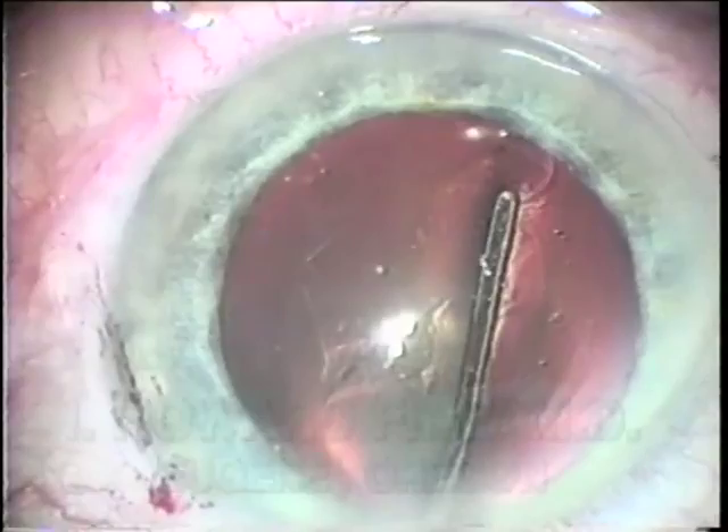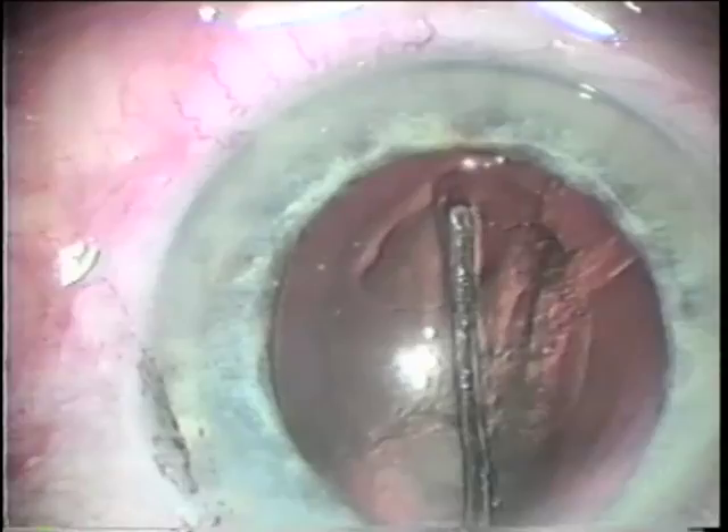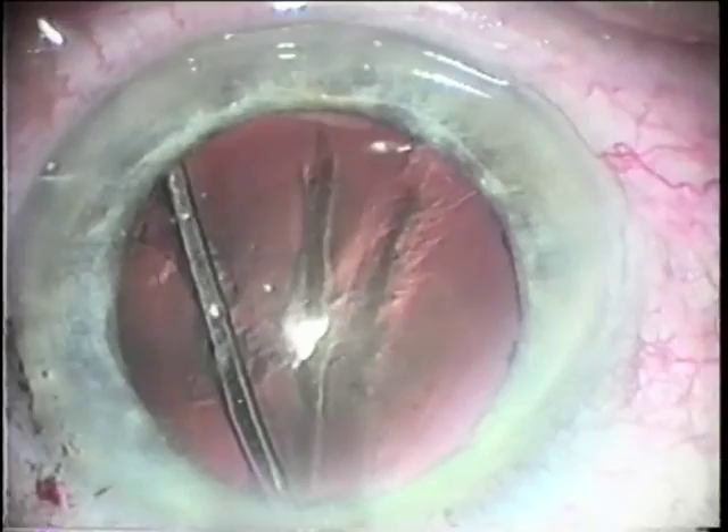While the classic description of hydrodissection was an injection next to the capsule, Dr. Howard Fine has recently been proposing that if, during hydrodissection, the cannula lifts the capsule before injection and is placed near the equator, the fluid wave will dissect more completely between the capsule and the cortex.